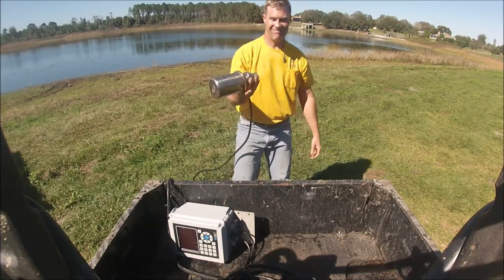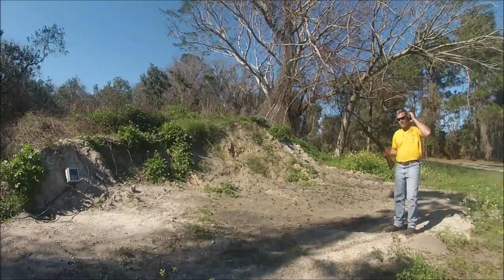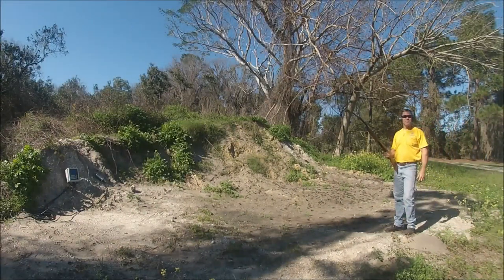Didn't even dent it. You've seen us drag it through the mud. You've seen us run over it with a truck. The only logical thing to do next is shoot it.